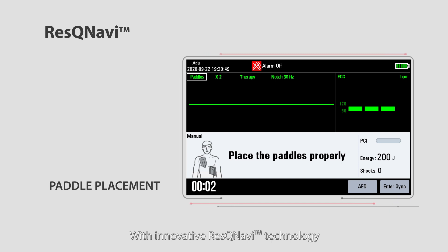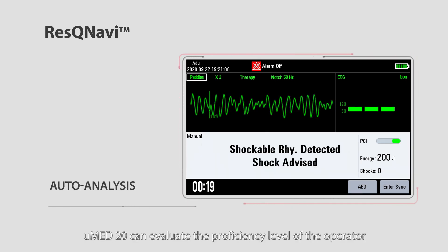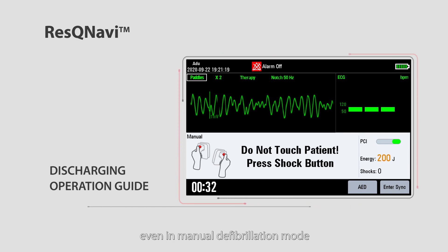With innovative Rescue Navi technology, U-Med 20 can evaluate the proficiency level of the operator, perform automatic rhythm analysis, and intelligently navigate the rescue process step by step, even in manual defibrillation mode.